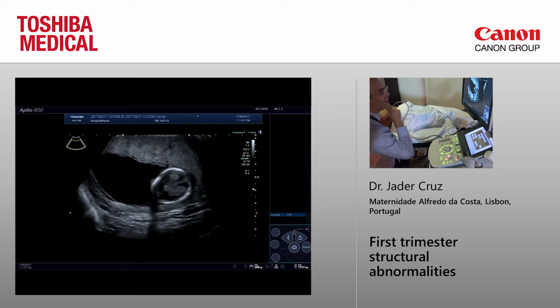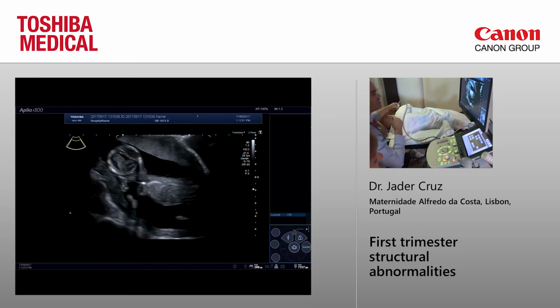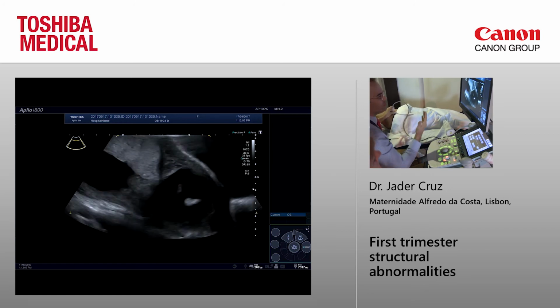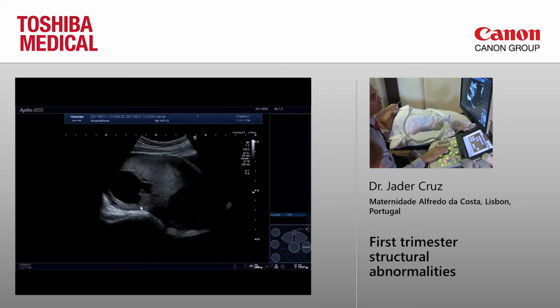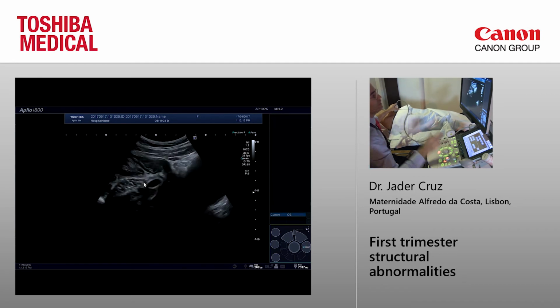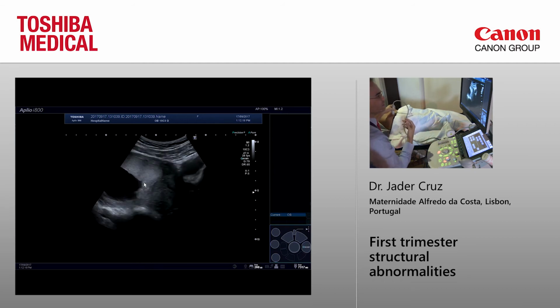That's okay. So when we're starting a scan, as I told you, we have an overview of the baby to see if the whole baby is there, and then you look at the uterus there, see the placenta flow, the placenta cord insertion, look if there is only one baby, 2 or 3 or 4, and if the baby is inside the uterus.